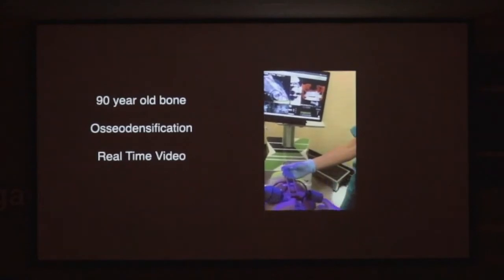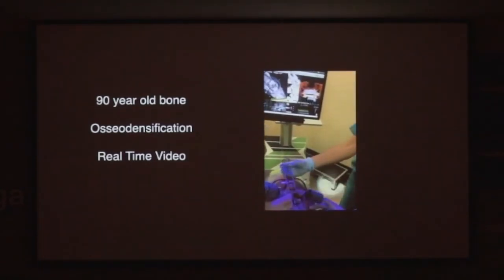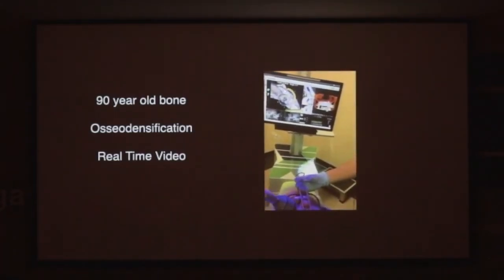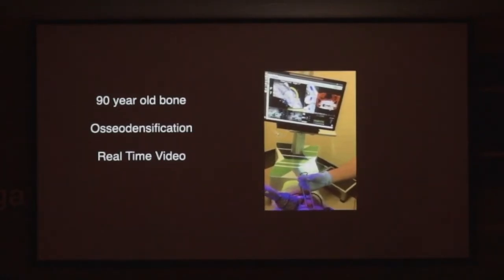Check. Slide it up a little bit. We're doing a system check, and we're adjusting the clip. More. You can see my staff is touching it down there. System check. Now show the position up here. So I'm looking up here. Now I'm drilling. You have to pump these things. You pump them, you're running in reverse, and you're not removing any bone, you're compressing the bone.